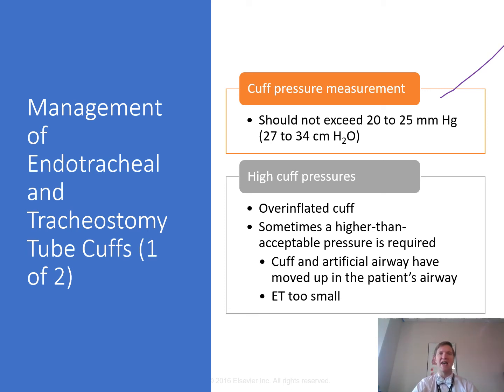The amount of pressure added must equal the pressure reading, so make sure it's approximately 20 to 25 millimeters of mercury, because you're using a blood pressure cuff, right? And it can be used simultaneously with the cuff being inflated and deflated. So there's a 5-step protocol that we'll go over here.